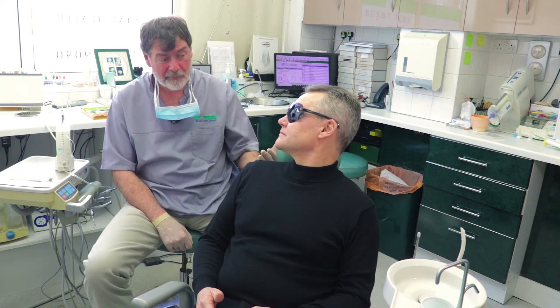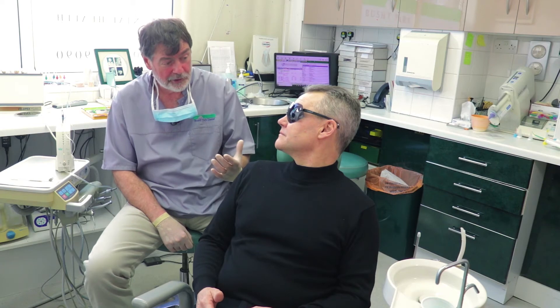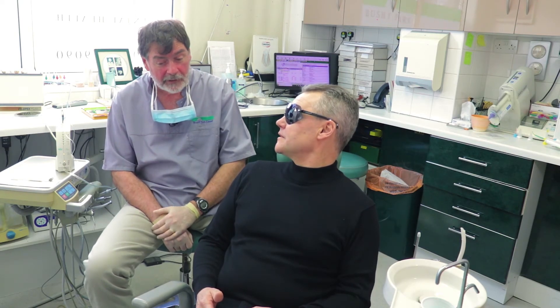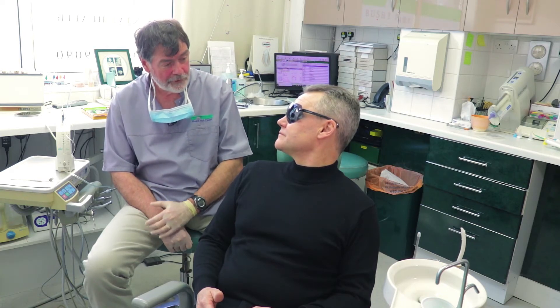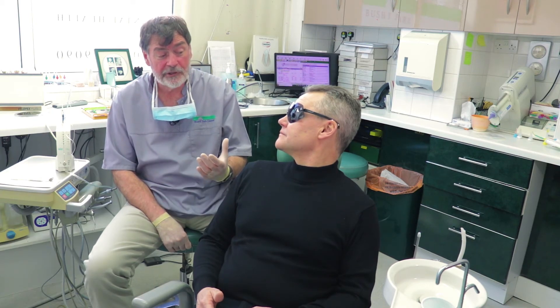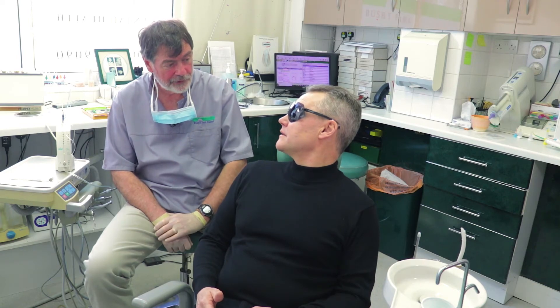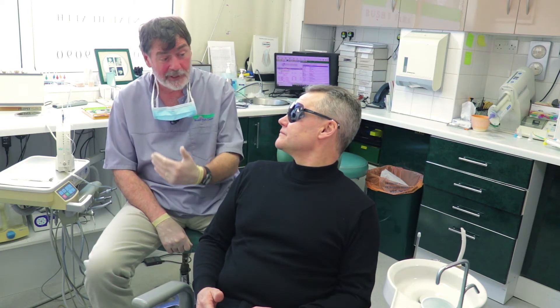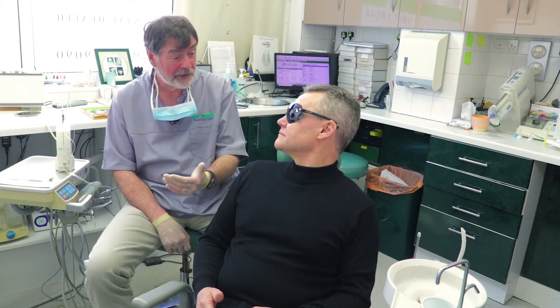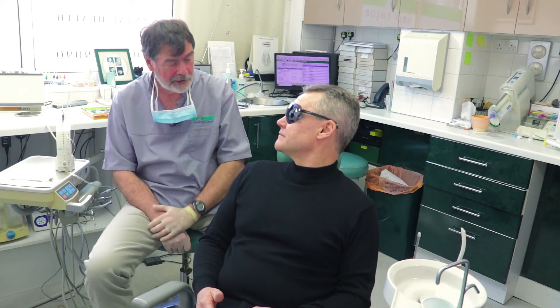We want to numb you up, you need to be numbed. We do this with the wand, it doesn't hurt, patients accept it, they quite enjoy it, and we just move on to the next stage of the appointment. With children, I've used this on children as young as two and a half, and with the right approach we can get away with numbing them up. Whereas in the old days you just don't do that — they end up crying at the very beginning of the appointment, everything goes south from there. Usually you get the child numb but get no dentistry done because they're too upset after it. So the wand has just changed my day completely.